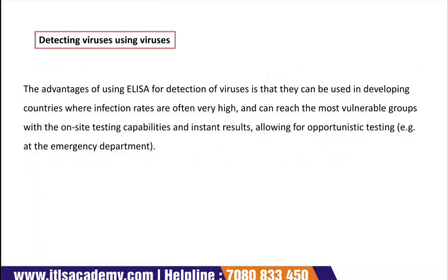Now moving further, ELISA also helps in detecting viruses. The advantages of using ELISA for detection of viruses is that it can be used in developing countries where infection rates are often very high, and can reach the most vulnerable groups with on-site testing capabilities and instant results.